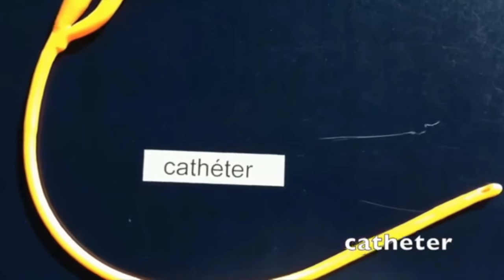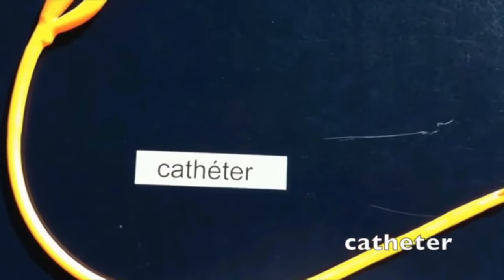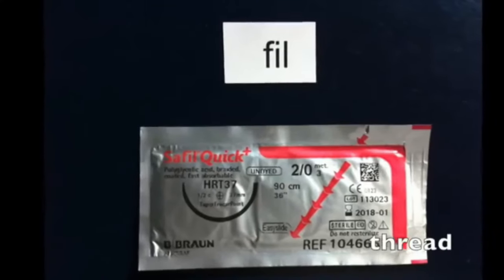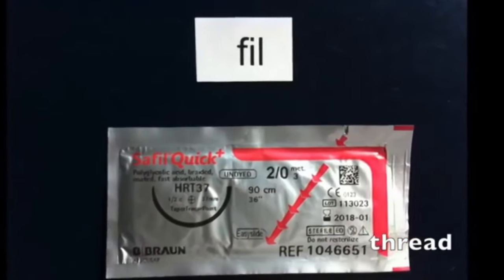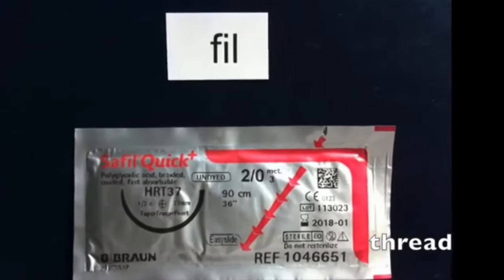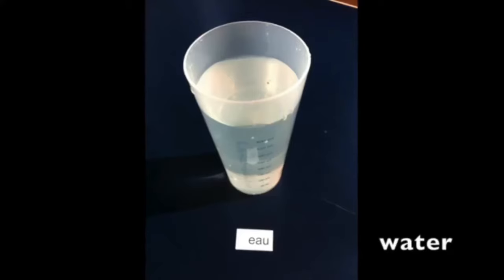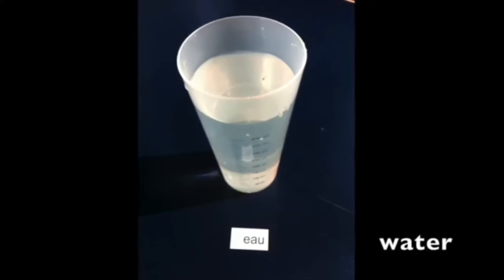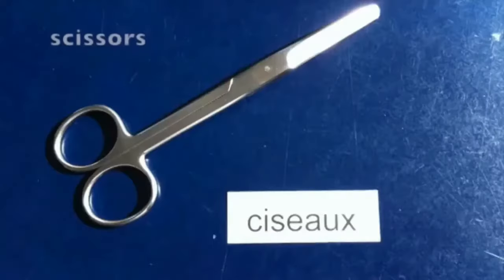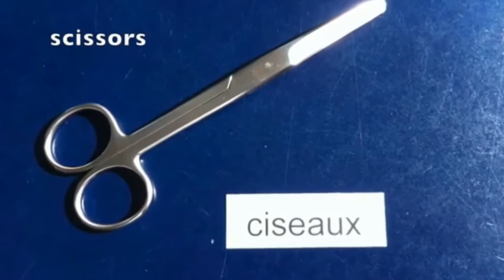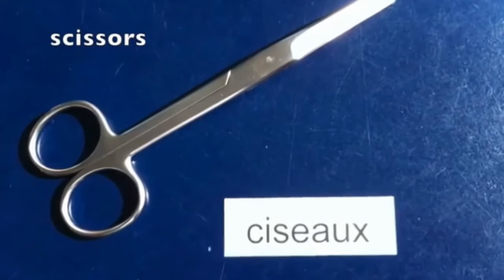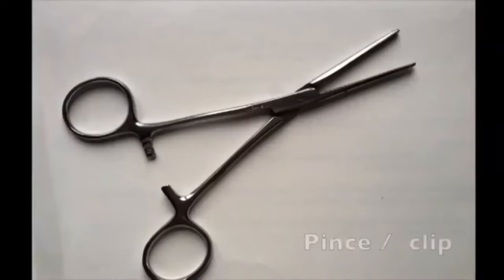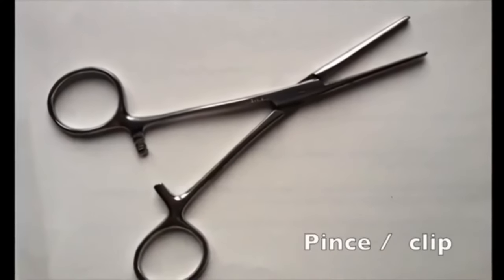You should have two of them. We need thread, we need ringer lactate or normal saline in a glass, or you can also cut the ringer lactate bottle. You should have scissors. This is an artery forceps to hold the catheters.